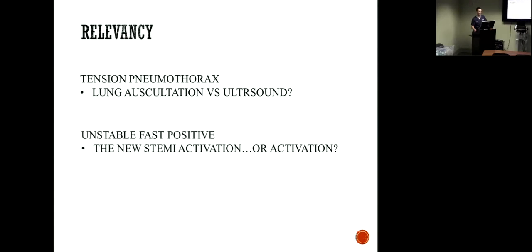They don't really need to hang out in other ERs for very long, especially if you can know the information ahead of time. They can call ahead to the trauma surgery team. And I think you, Jeremy, talked about red versus trauma alerts. If you've got even normal vitals but a positive FAST, you could probably read that and have the surgeons down there right away.